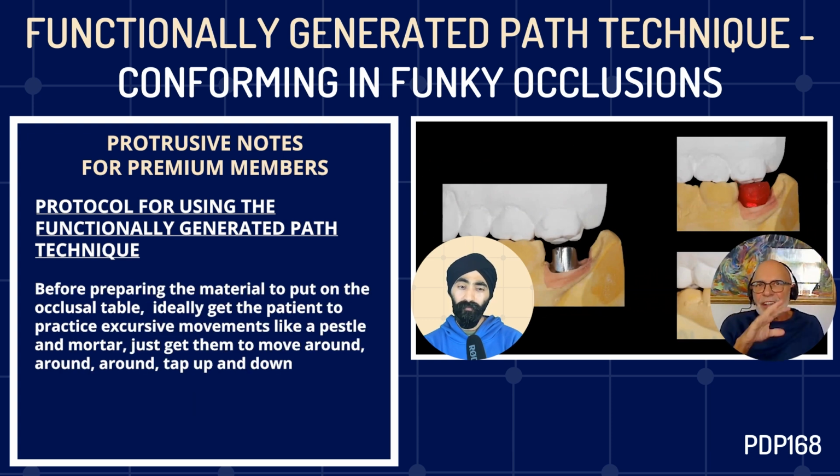Ideally you get the patient to practice excursive movements first. Sometimes I feel my patients are dyslexic. You say, move your bottom teeth forwards, and they move their head, and you say, can you move your bottom teeth to the left, and they move their head. So you want to get the patient to practice excursive movements. A bit like a pestle and mortar, just get them to move round, tap up and down.